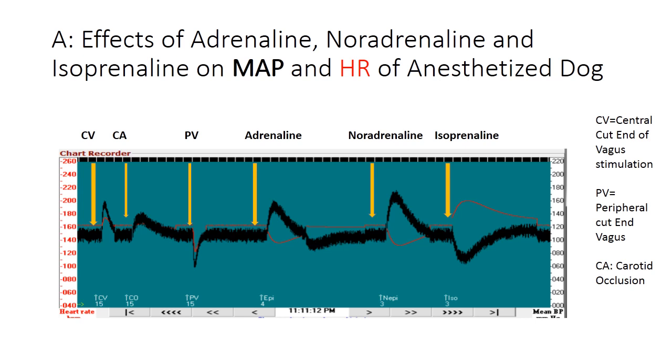After the biphasic response of adrenaline is seen, the noradrenaline effect is seen, which is only a rise in mean arterial pressure associated with fall in pulse rate or bradycardia. As compared to these two responses, isoprenaline causes rise in the pulse rate and fall in the mean arterial pressure. So isoprenaline only gives a depressor response.